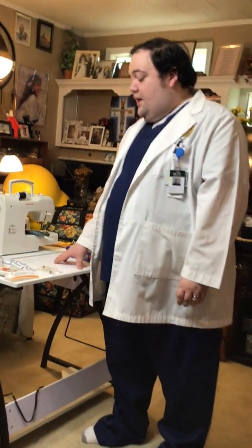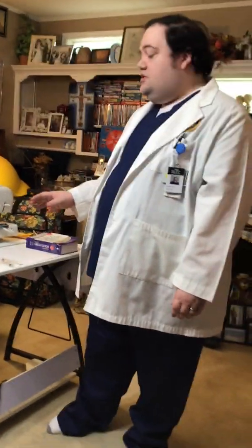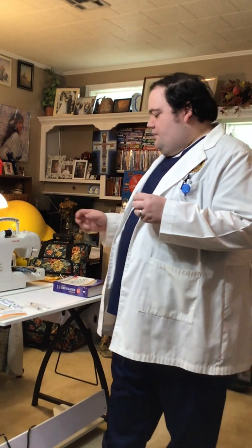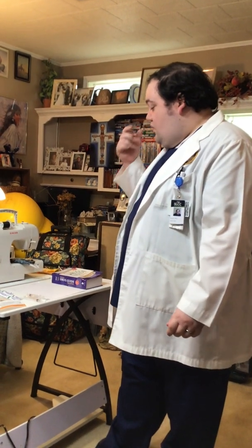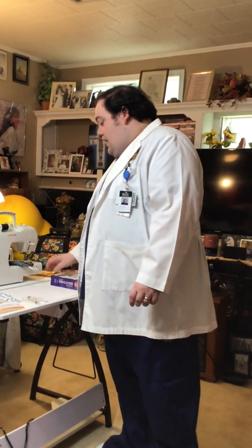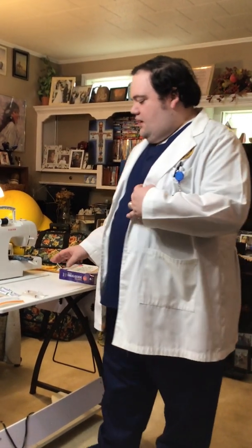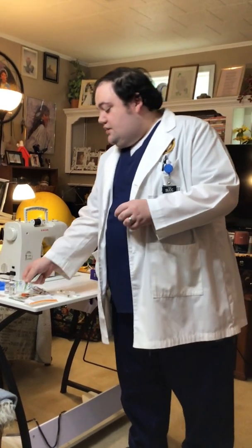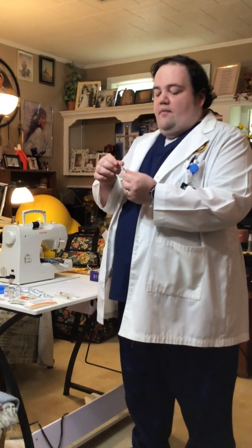All right. After I've done that, I'm going to prepare to draw the medication up into the syringes. At this point, I'm going to verify the order of the drug the 3rd time. And when I'm drawing up the medication, my focus on verification is not only the right drug, but the right dose, once again. So we're going to start with drawing up our iron dextran. I'm going to start with that because for purposes of this demonstration, our iron dextran is going to be in the form of a glass ampule.